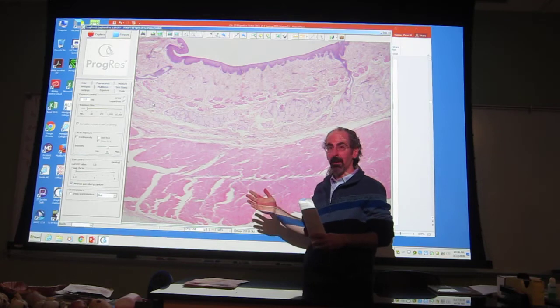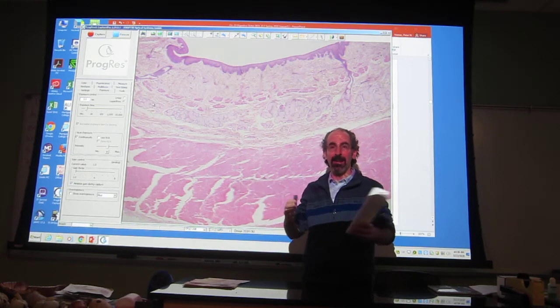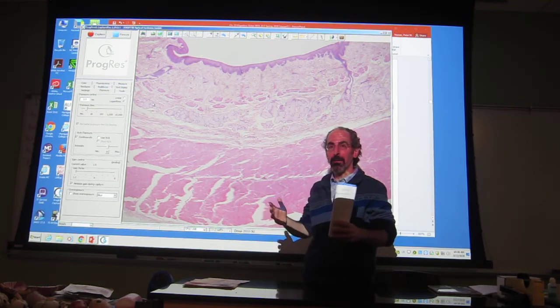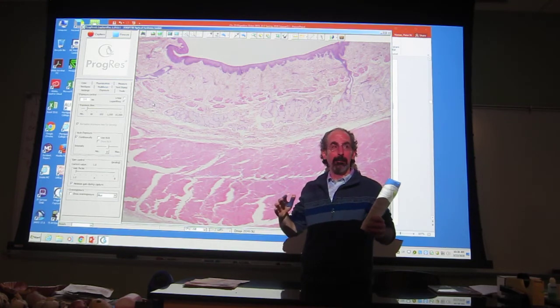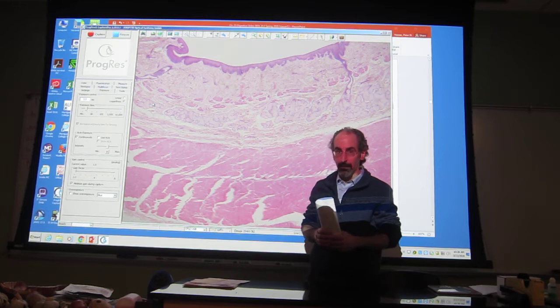Because of the circumstances, you will not have a chance to look at these unless you own a microscope and slides of your own at home, so I'm doing this now to help you along, in the hopes that it gives you further context and assistance for the upcoming lab exams.